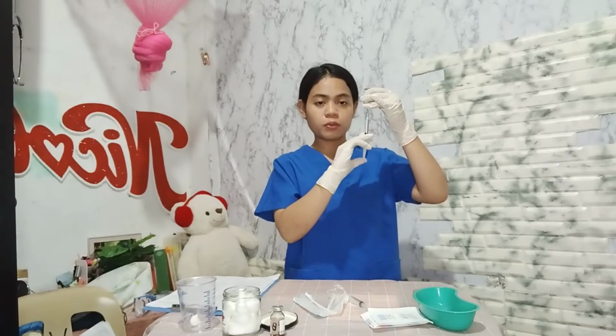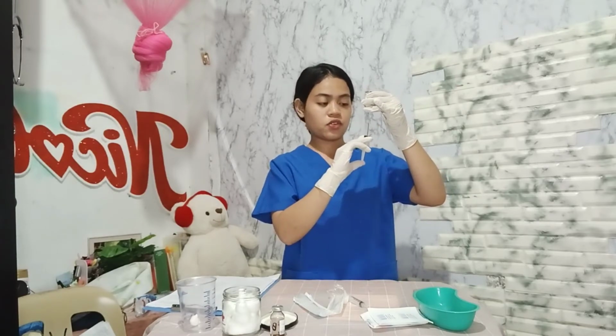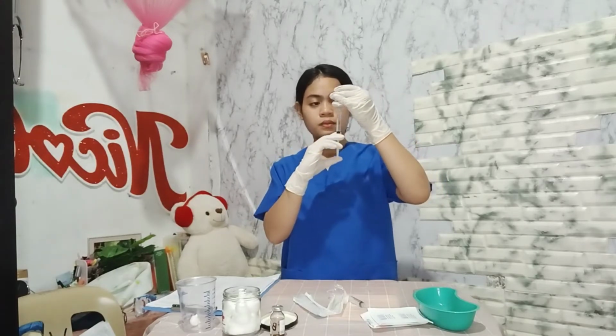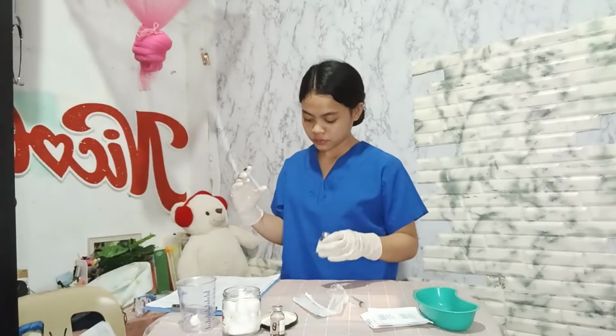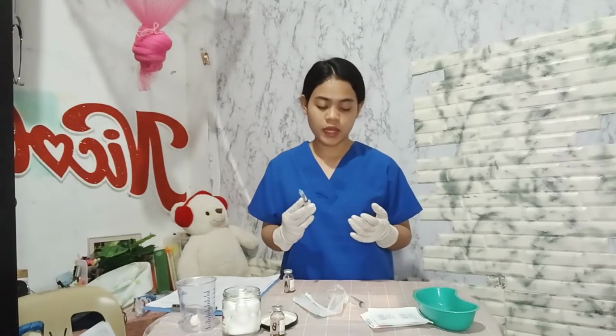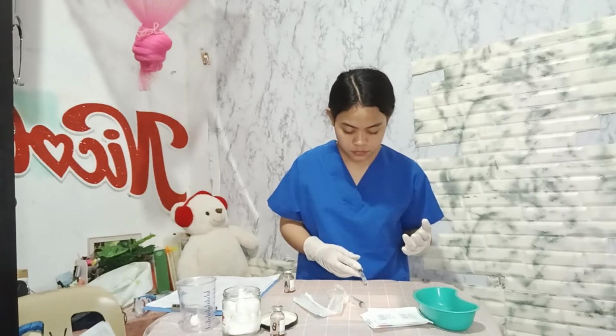When the correct volume of medication plus a little more is obtained, then withdraw the needle from the vial and replace the cap over the needle using the scoop method to maintain its sterility.